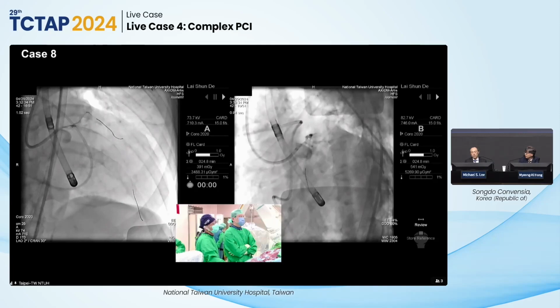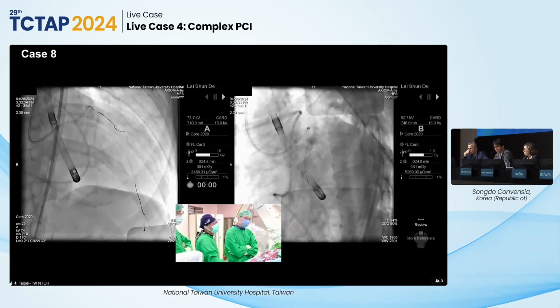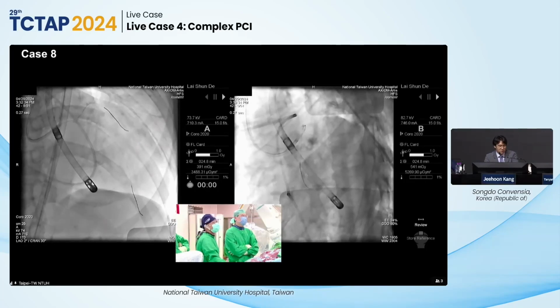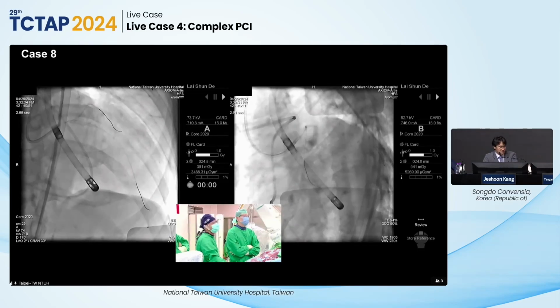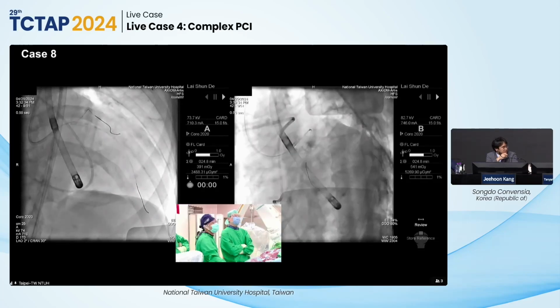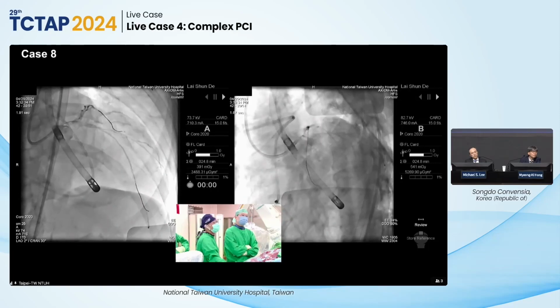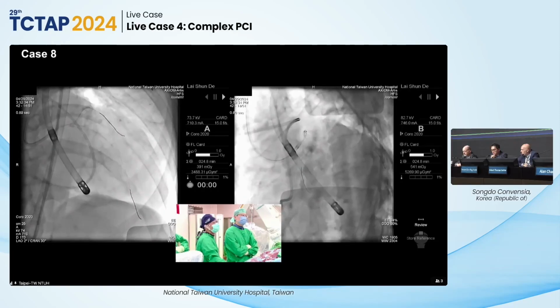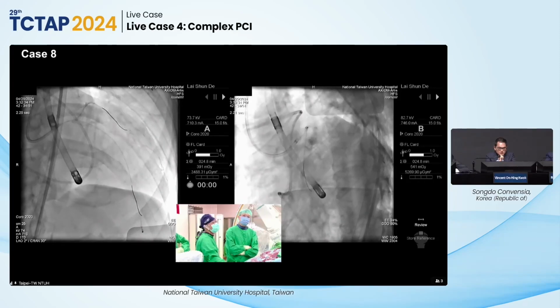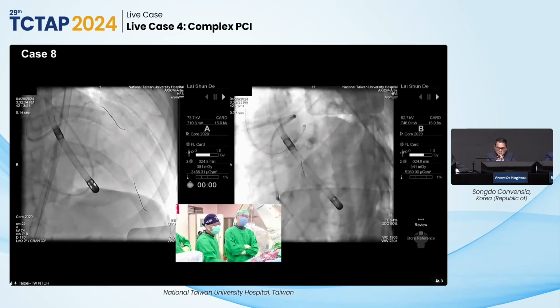Probably related to that, from the IVUS we could see that the reference diameter was really small in the distal parts of the LAD and circ, which also relates to probably this muscle not having viability, as discussed in the previous comments. Prognostically, the left main LAD is more important, so make it simple. Probably a lot of the myocardium is already fibrotic, so fix the left main LAD. I think the circumflex is diffusely diseased. No matter what you do, you can't get good results anyway.